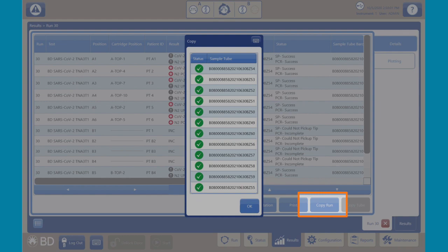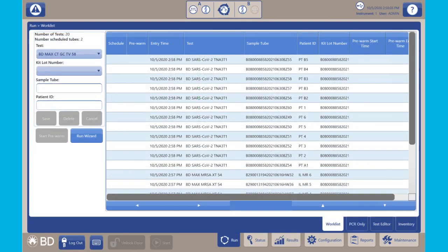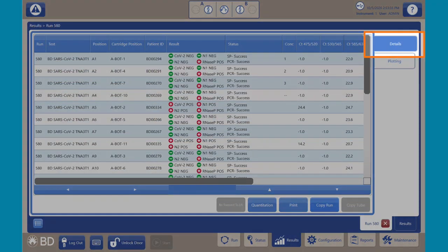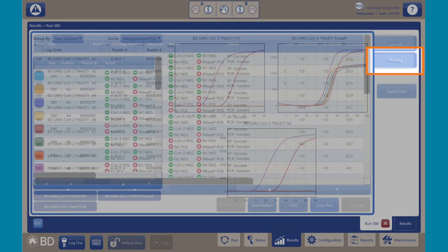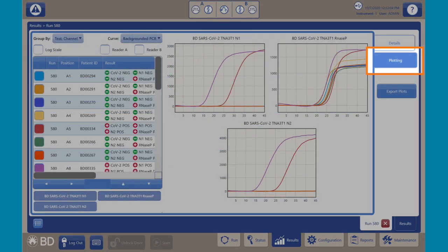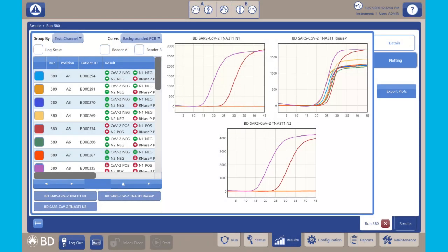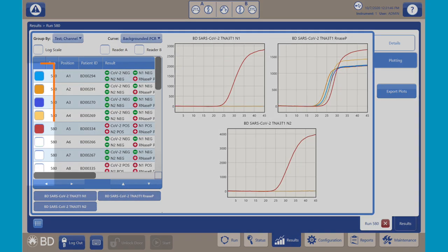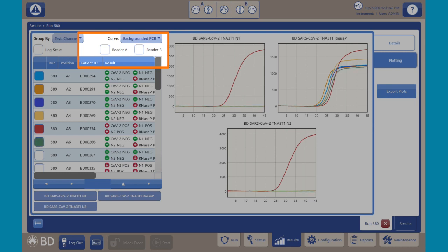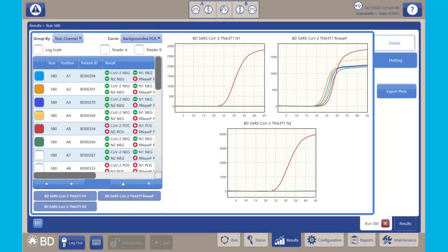Copy Run will copy the samples logged in for that run back into the work list. The Details tab appears by default when a run is displayed. The plotting display allows you to view PCR curves for past runs. By default, only the channels used in the test are shown, and all positions are shown. Use the position color checkboxes and the reader A or B checkboxes to view and hide specific positions. The color of the position checkbox when filled corresponds to the curve's color in the graph.